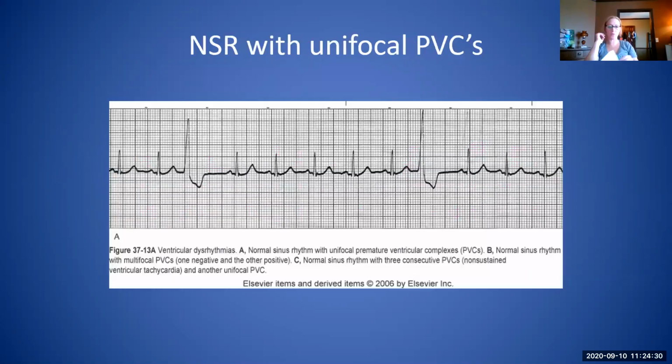All right, then you have your normal sinus rhythm with PVCs. So your sinus rhythm with PVCs, it can be benign. Your PVCs are your premature ventricular complexes. I don't have PACs on here. I need to add a slide with PACs.